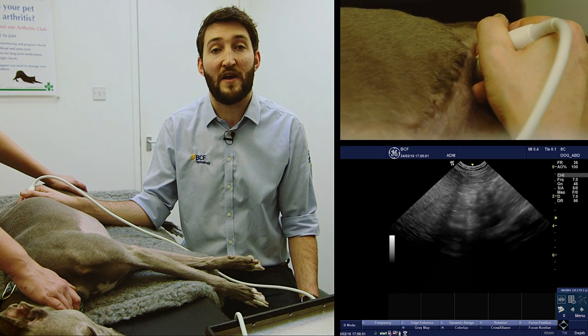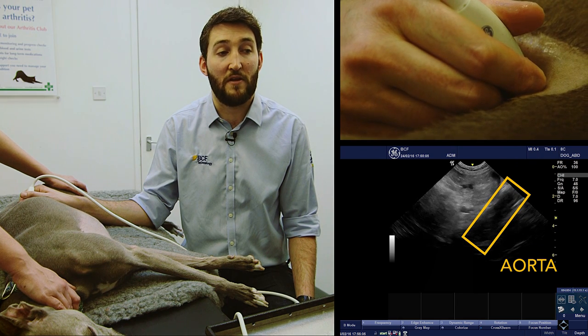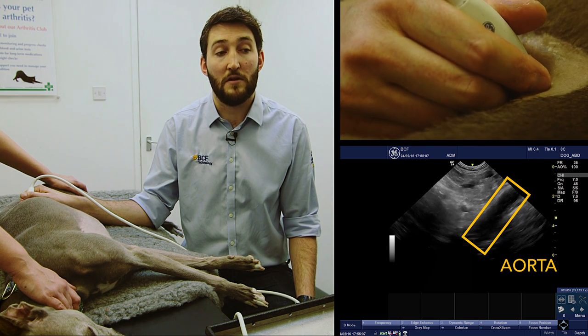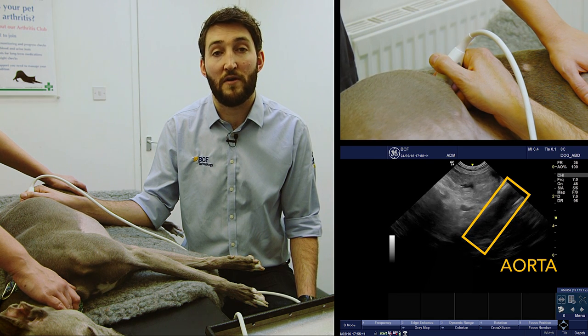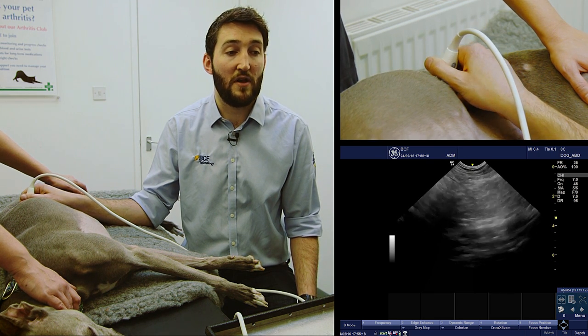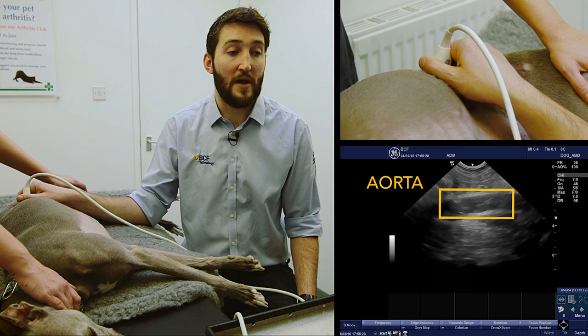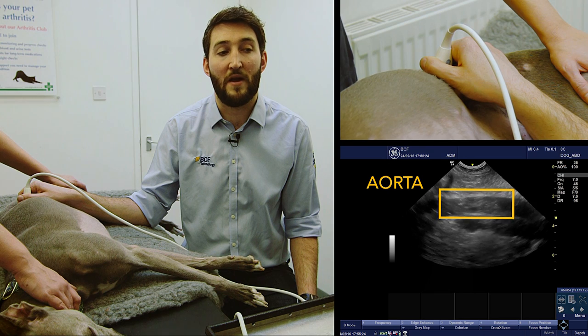Once we come off the dorsal border of that organ, stop, and then we're just going to fan back ventrally — back the way we've come — until you can see on the screen we've got this large blood vessel going from top right to bottom left. That's pulsing — that's our aorta. And if I just rotate the angle of the probe slightly and make a minor fanning adjustment, you can just see another large vessel coming in below that on the screen.